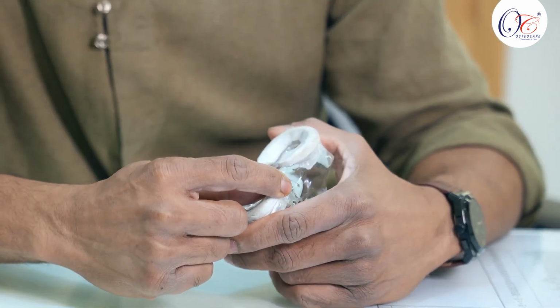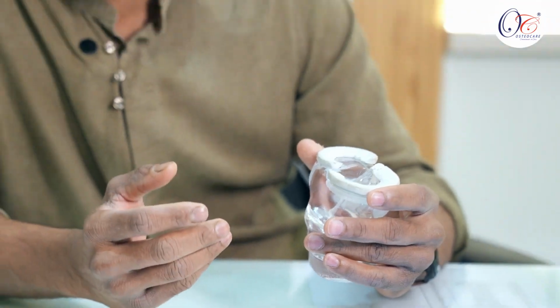Whenever this posterior root is torn, traditionally we used to repair it by a transtibial tunnel technique where we used to drill a long tunnel in the tibial bone, take suture bites in the meniscal root, pull the sutures through the drilled tunnel and tie it over the tibia. So the meniscal root is here, the tear is here, and we are fixing it here, which is quite far from the actual tear. Also, when we drill the tunnel, we need at least 4.5 mm to 5 mm diameter of tunnel, which is quite big.